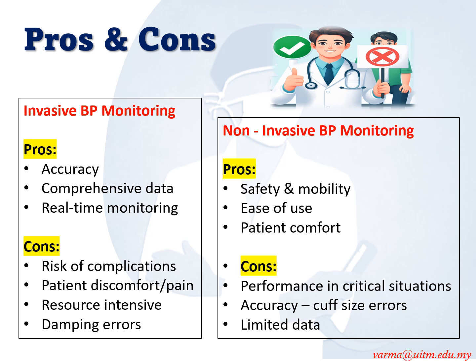It is very resource intensive compared to non-invasive blood pressure monitoring, because the consumables are much more, and maintenance of an arterial cannula needs expertise to prevent further complications. And even though invasive blood pressure monitoring is known for its accuracy, if the system is damped, there can be an error in blood pressure monitoring.